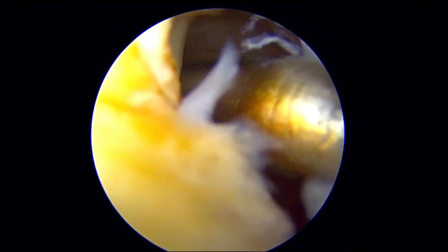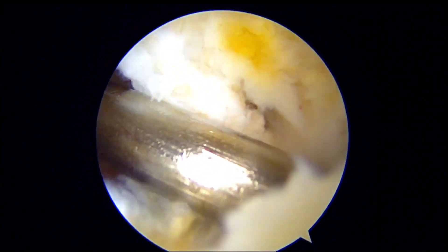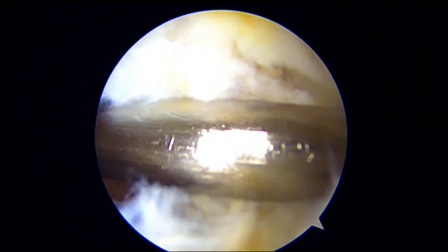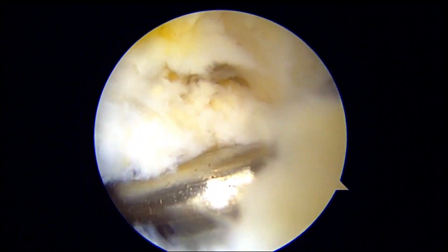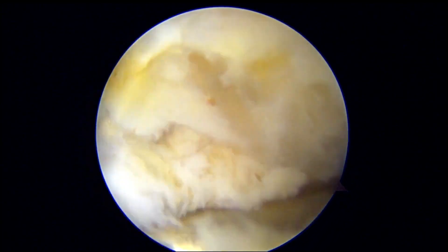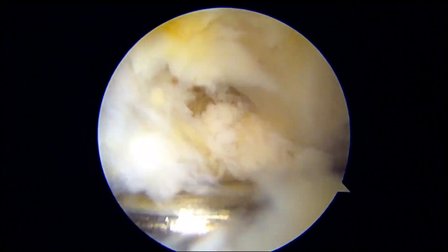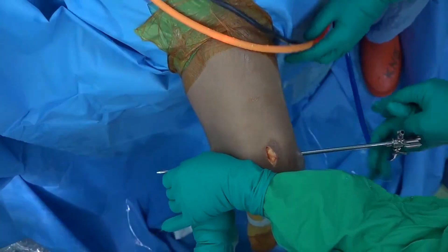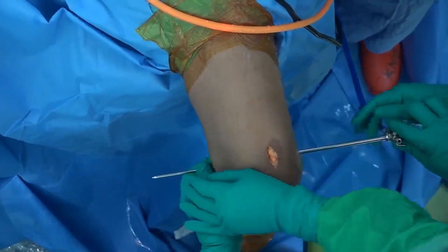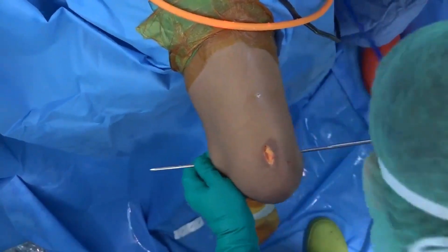After creating the posteromedial portal, a blunt rod was inserted and passed through the posterior septum just behind the remnant PCL, traversing the posterolateral window into the posterolateral space directly behind the lateral meniscus. This rod could be visualized directly. The rod is protruded towards the lateral side. This posterolateral portal should ideally be positioned between the LCL and the lateral biceps head. Ensure that the posterolateral portal does not extend posteriorly as the peroneal nerve lies behind the biceps. The trocar sheath is then repeatedly passed in and out from the lateral side to clear the pathway and partially free the septum.